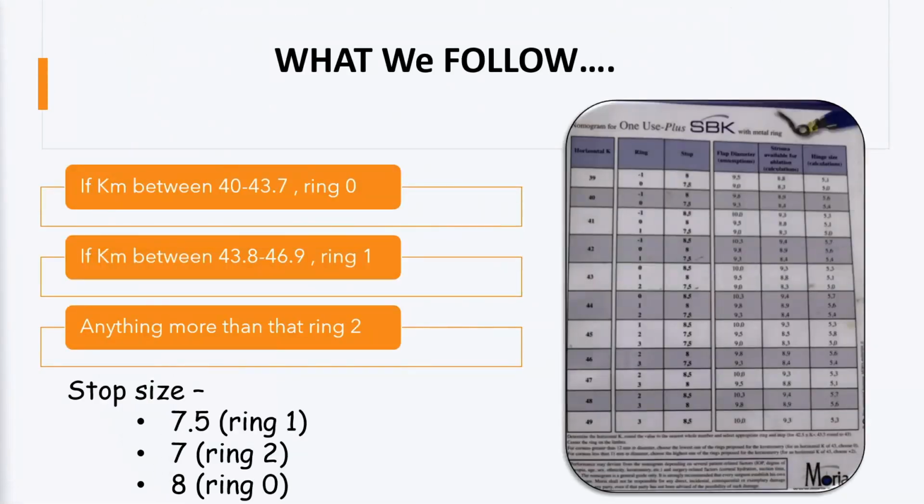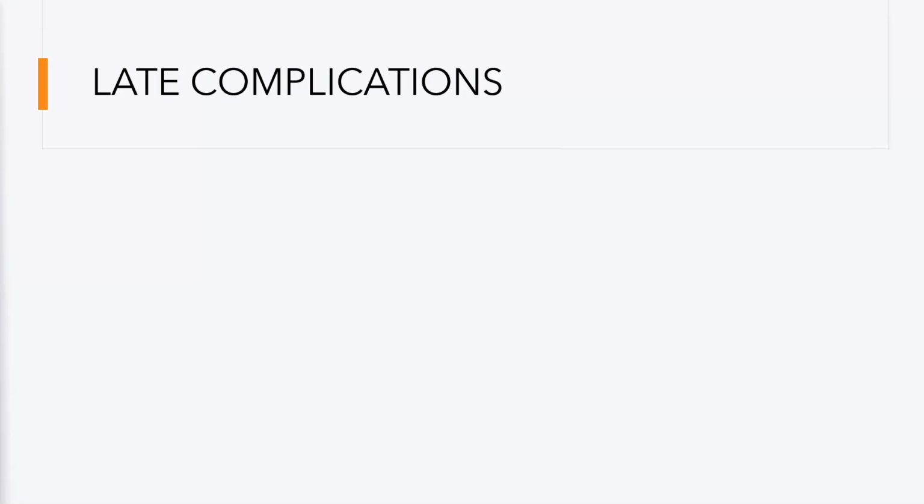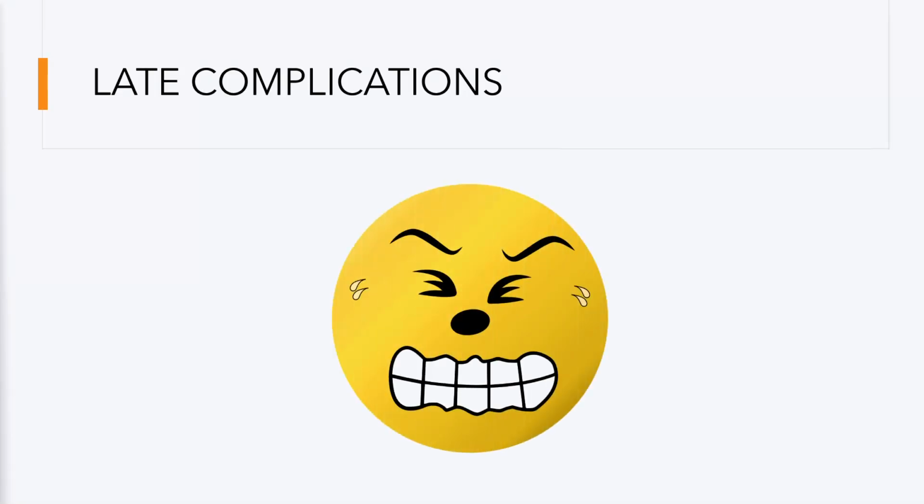Whenever we take extreme cases, when we are using SBKs, we tend to take a stop less than what is recommended by the nomogram. Like when we are dealing with a very small cornea, instead of going in with a ring of 2, with a stop size of 7.5, I generally prefer taking it as 7. So this is your customization about your LASIK. As you customize your A constant with your IOLs, we customize our stops with the experience we gain out of our microkeratomes. But still, after doing the best of the surgery, you can of course encounter late complications.